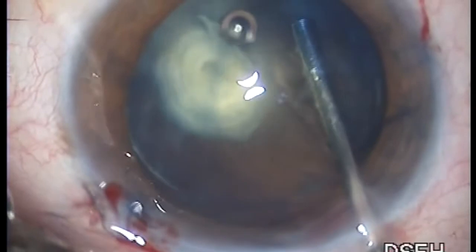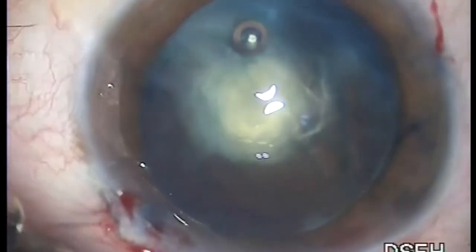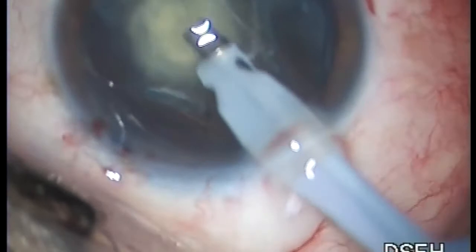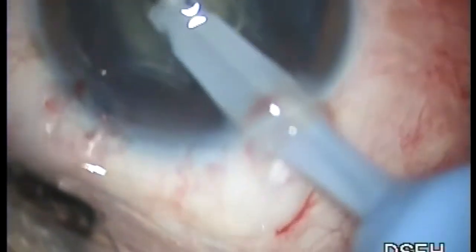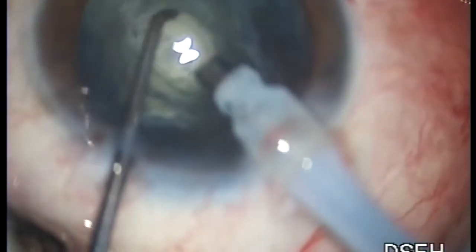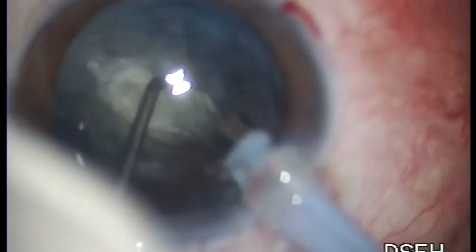This fluid injection technique is not right and could be a cause of posterior capsule rupture.